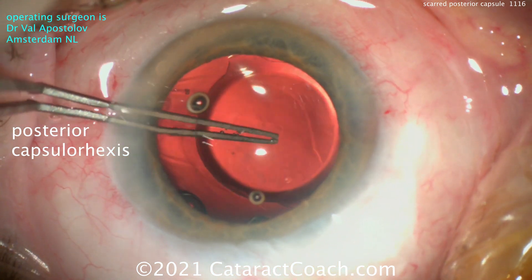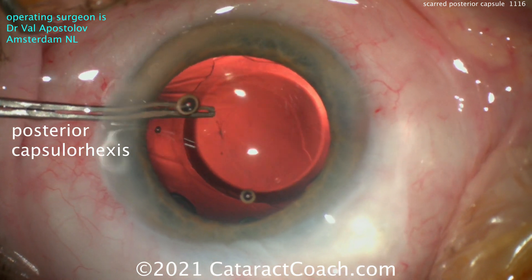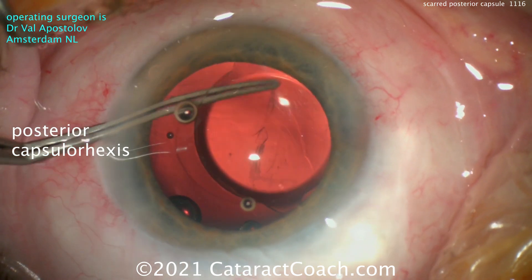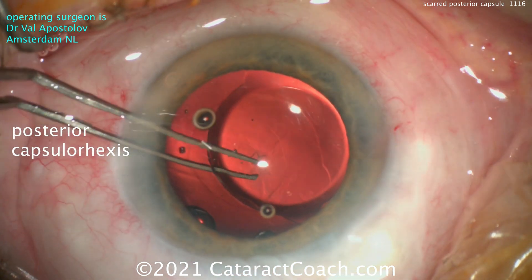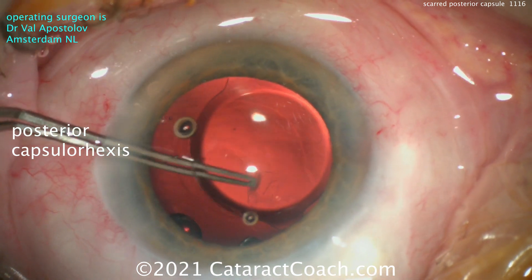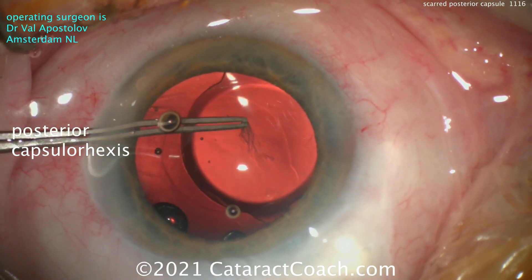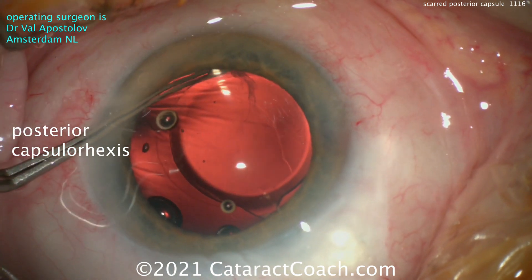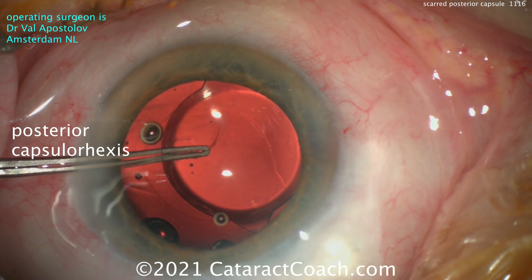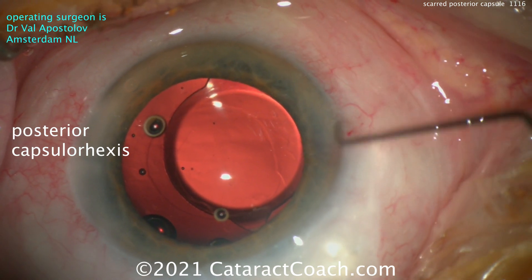He's going to go underneath and create a posterior capsulorhexis — the technique is very similar to an anterior capsulorhexis but actually easier in some respects. The anterior capsule is like a dome and wants to run outward toward the periphery, whereas this posterior capsulorhexis wants to stay inward because you're operating on a bowl shape. One technique I like is to make a small opening in the posterior capsule and inject a little viscoelastic into the sub-hyaloid space to create a barrier. He's creating a nice round rhexis here. Val is a very talented master surgeon with tremendous experience — this is not something I recommend for average surgeons early in their learning curve.